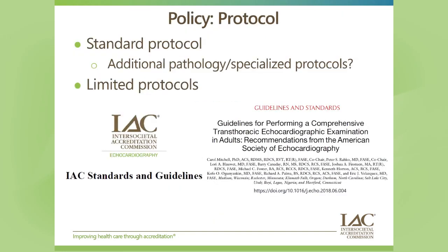Depending on your modality and your institution, you have your standard protocol that's kind of your baseline. And then hopefully with additional pathology, you might have some specialized protocols, or maybe you follow the guidelines that are established for your modality for working up those different portions of the exam for what you're seeing as a sonographer, but ensuring that your protocol is meeting standards, of course, by IAC and hopefully your society that you are engaged with.